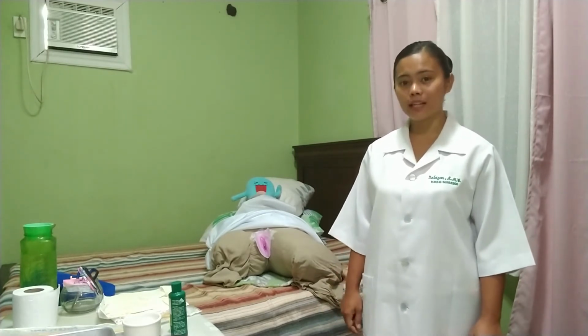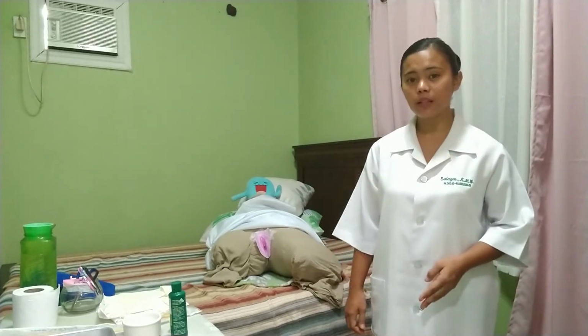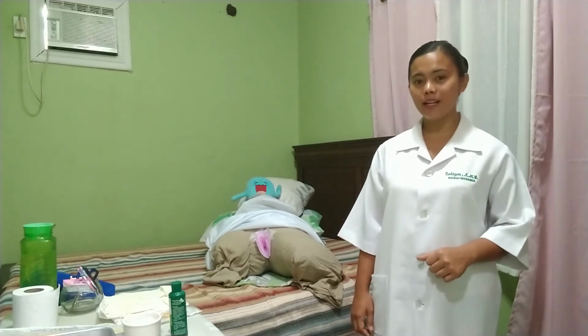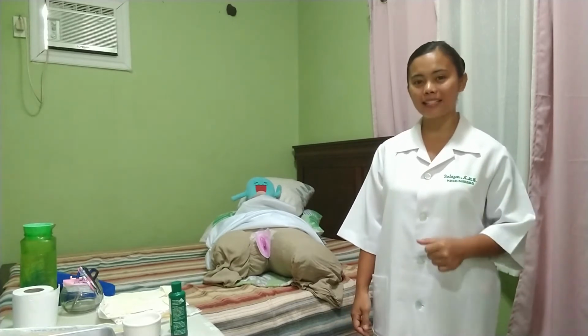see the urinary meatus. After the draping process is done, the next thing to follow is the perineal care. Since we already have done the perineal care, you may refer to the video previously. I will link it here down below for your access.